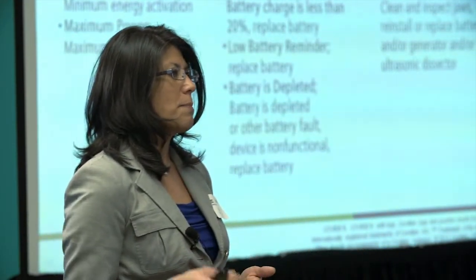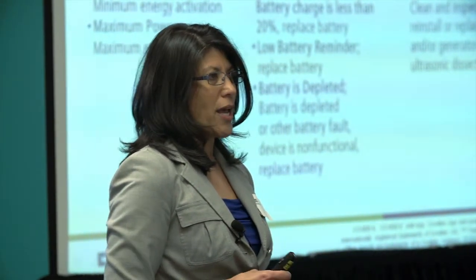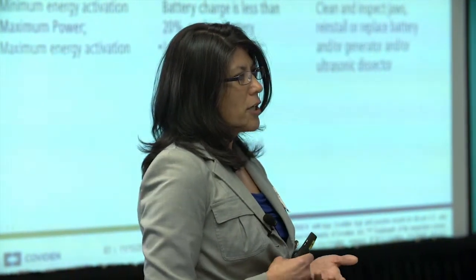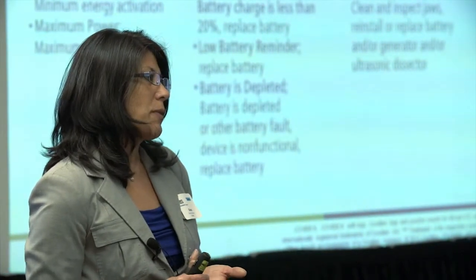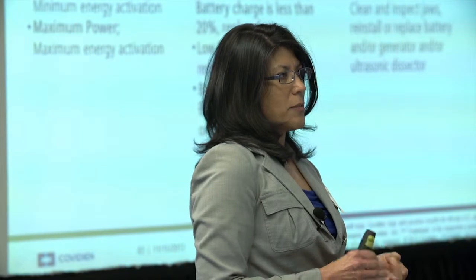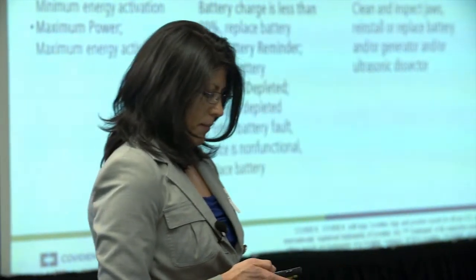So what we did was we went back to the standards. Yellow means caution. Okay, we want to warn the user that the battery's going to go in a little bit. So we gave them a yellow, we gave them an audio tone, and then we gave them flashing. Because what we found was that even though we gave them the tone and we gave them a yellow indicator, they didn't always recognize it. But once we threw in the flashing, they actually did recognize it. So I'm hoping that this is going to play.